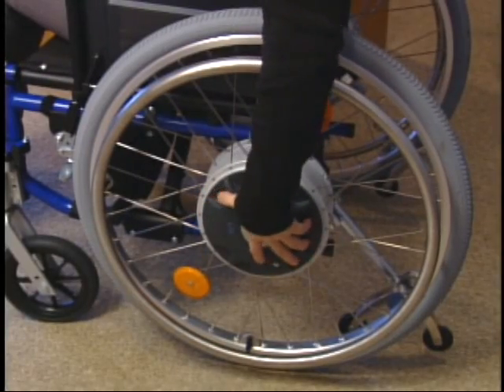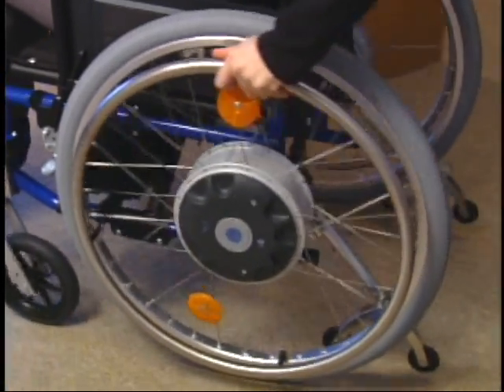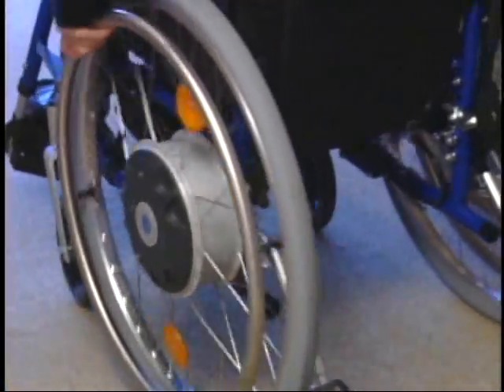Turning the locking plate on each wheel turns the drive wheel into a manual wheelchair, ready to be pushed without motor assistance.